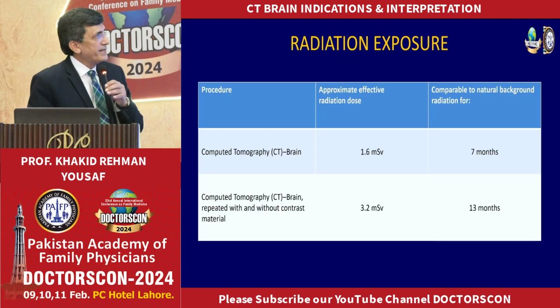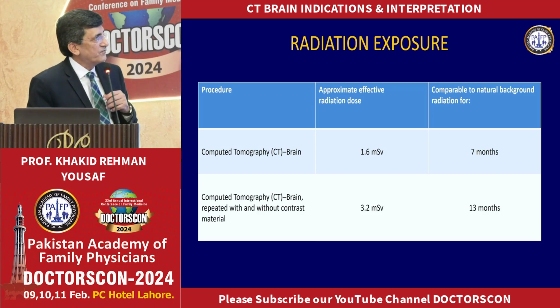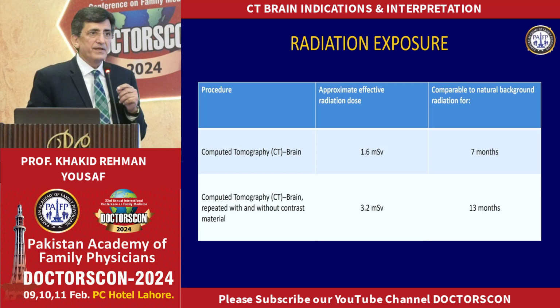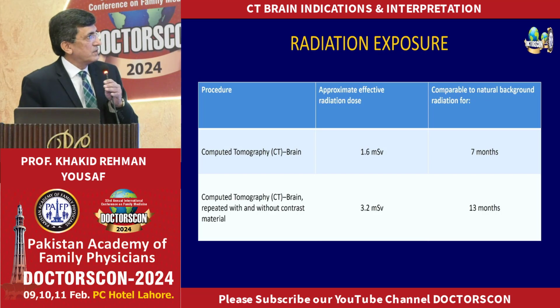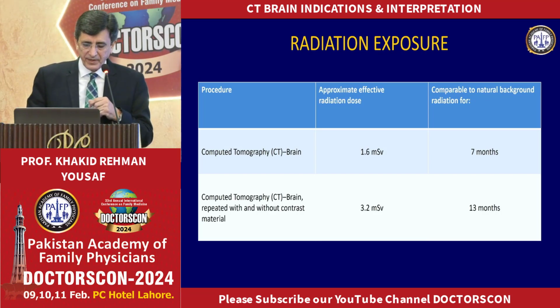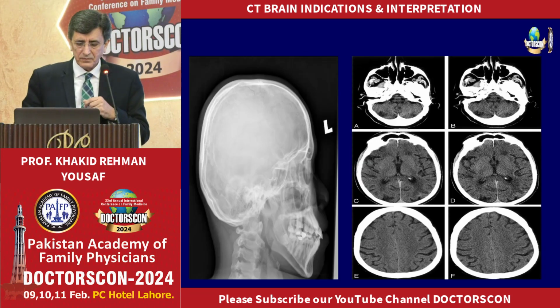The unit for radiation is millisievert. One CT scan gives about 1.6 millisievert of radiation to a patient, which is comparable to natural background radiation of 7 months. So a lot of radiation is involved, and we have to evaluate the patient before referring them for a CT scan.